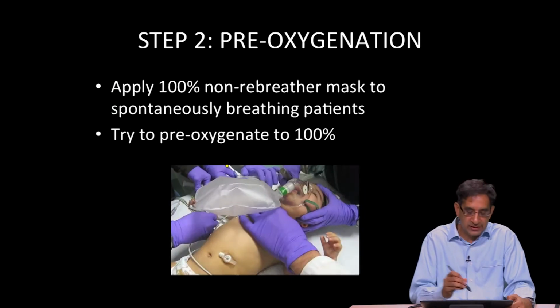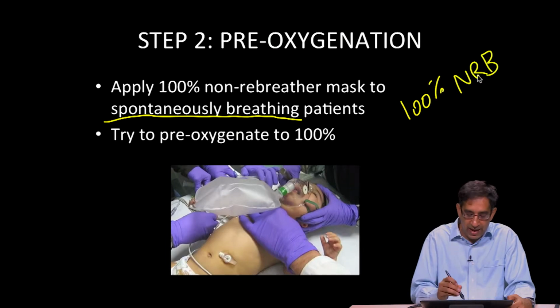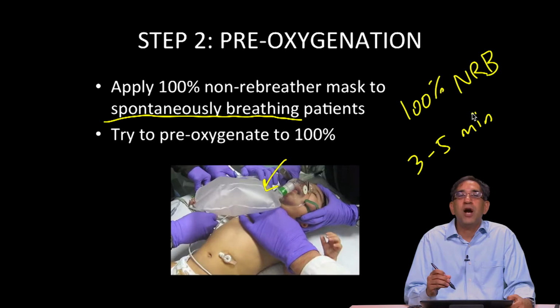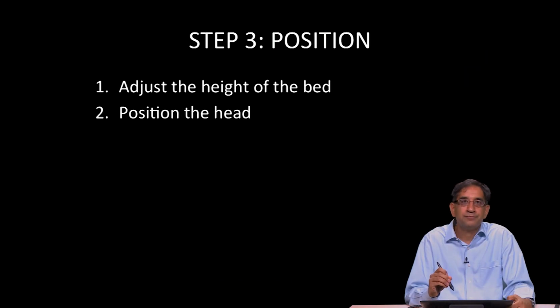If the patient is spontaneously breathing, if they're already breathing and breathing adequately, then all you need to do is place them on a 100% non-rebreather mask, as seen here, and let them breathe from anywhere from 3 to 5 minutes, and they will pre-oxygenate themselves. And generally what you're trying to do is get them to an oxygen saturation of 100%. And again, this generally takes 3 to 5 minutes, and they're going to wash out all that nitrogen and create an oxygen-rich reservoir within their lungs from which they can draw from.